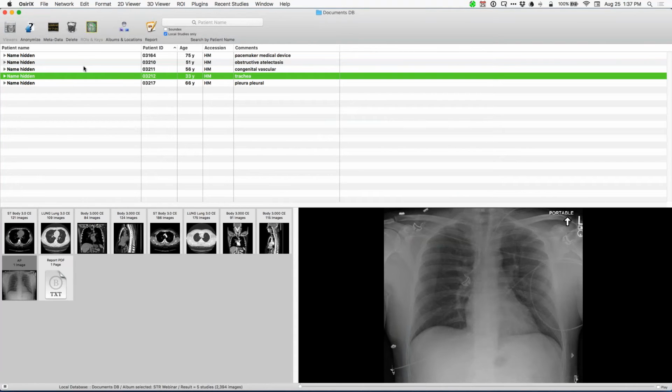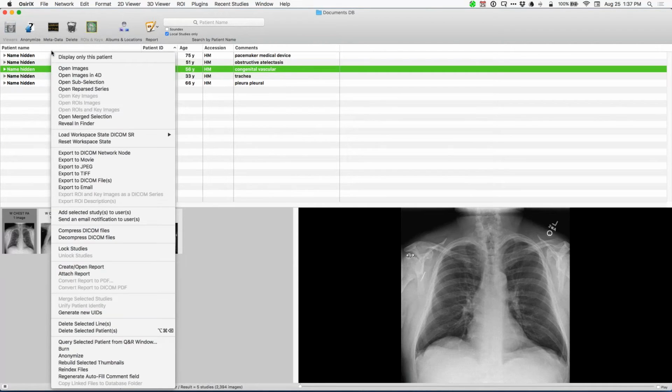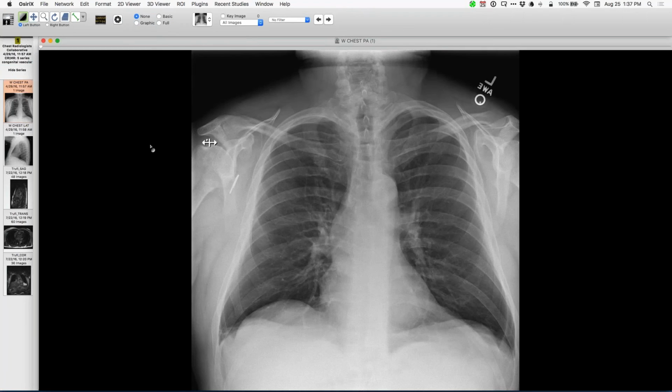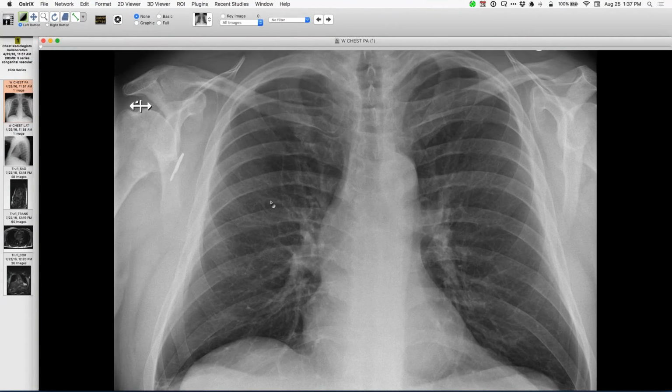And let's see what this one is. Okay, this is just a nice example of a person without a right-sided SVC. Now, I know I wouldn't diagnose this. Lev kindly showed this one to me, but after you've seen the MRI, which I'll show you, it kind of explains why there isn't any shadow here that looks like an SVC in this location.